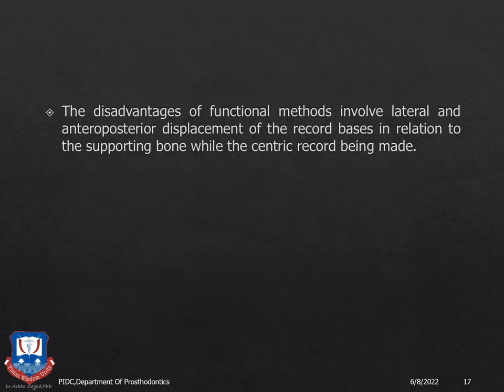So the disadvantage of the functional method is that they involve lateral and anteroposterior displacement of the record bases in relation to the basal tissues and supporting bone.